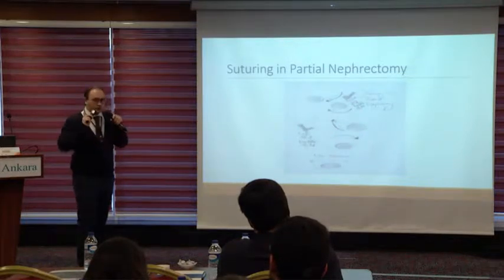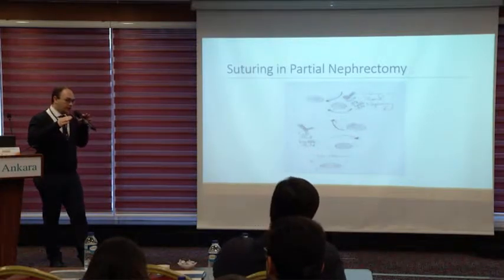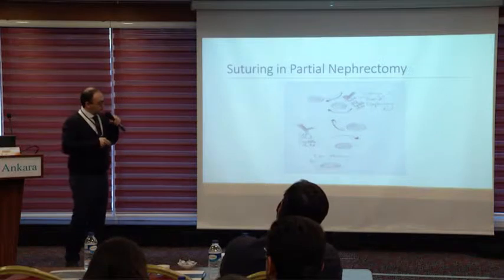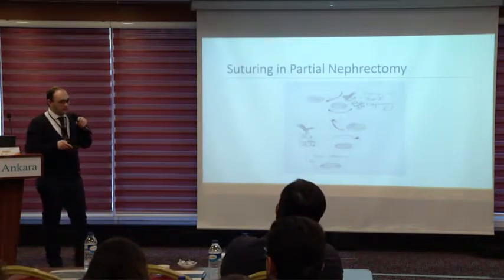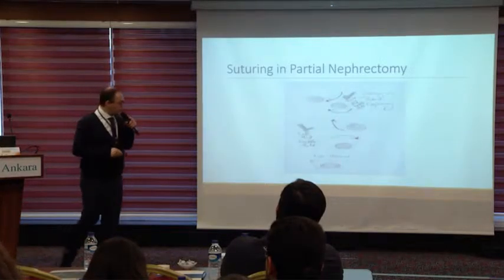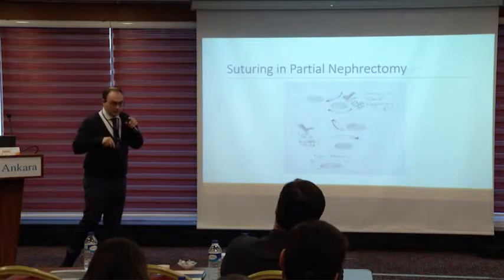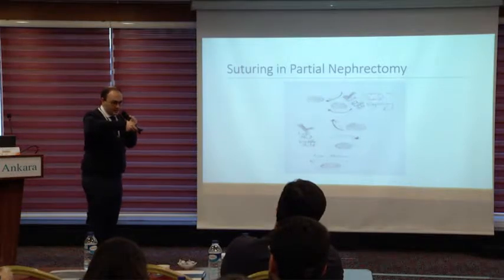This will save your time. This will not let you fall in an unknown place, and this will aid your hemostasis. And you see my net movement is absolutely 0. After finishing my 1 suture with the 0 movement, I will make a movement with my needle holder in the Z-axis.